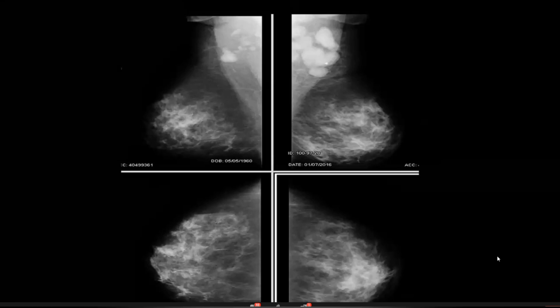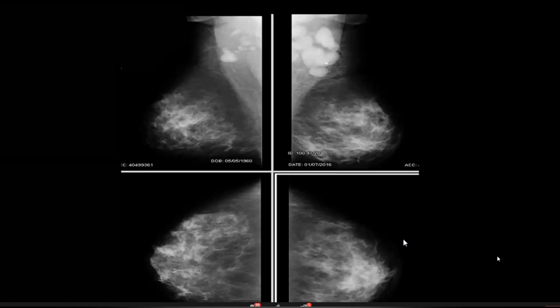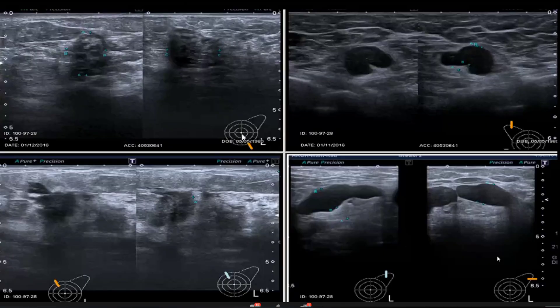Spot the lesion on the left breast. We find multiple enlarged axillary lymph nodes on the left side as well as on the right side — definitely suspicious. On MLO views, this is heterogeneously dense, with an irregular ill-defined asymmetric lesion — BIRADS 4. Ultrasound reveals an irregular, ill-defined hypoechoic lesion that is taller than wider — BIRADS 5. The left axillary lymph nodes show increased cortical thickness, and the right axillary lymph nodes also show a thickened cortex.